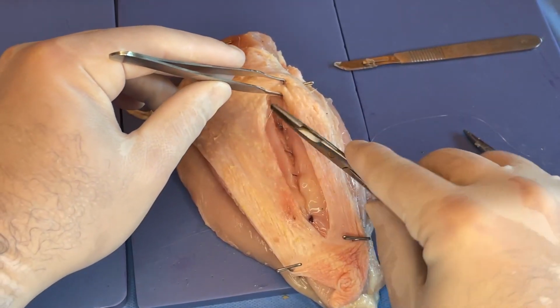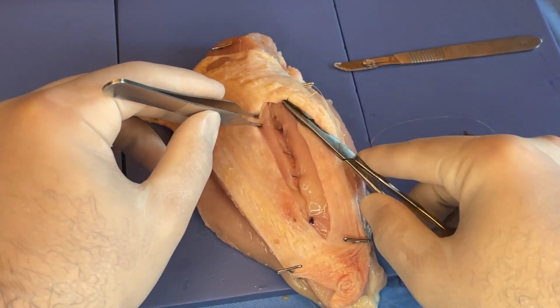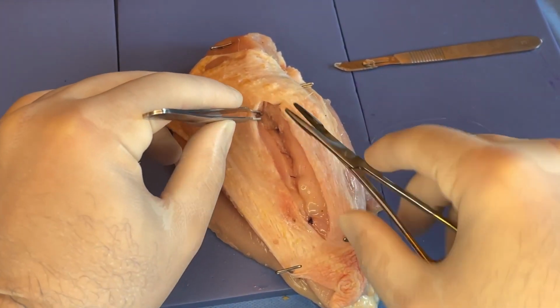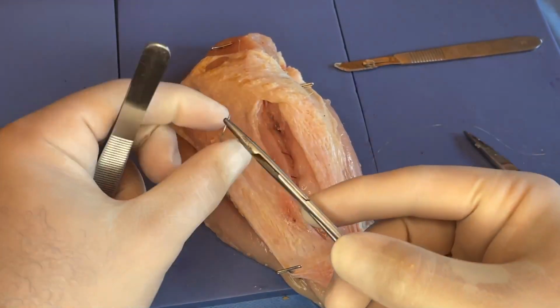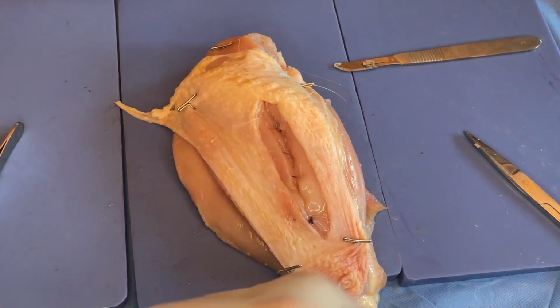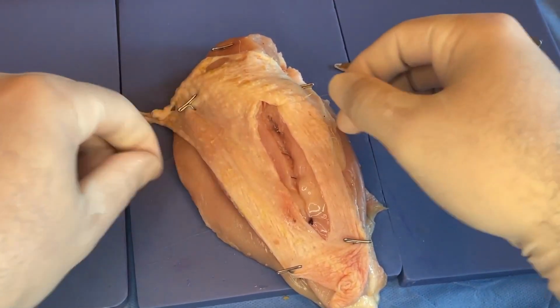So with the subcuticular, I start that off with a bite that's actually below the skin, that's kind of deeper down, and this is just to anchor this suture. So I'm going to pull that through. I don't have my reading glasses on. I'm going to try to.